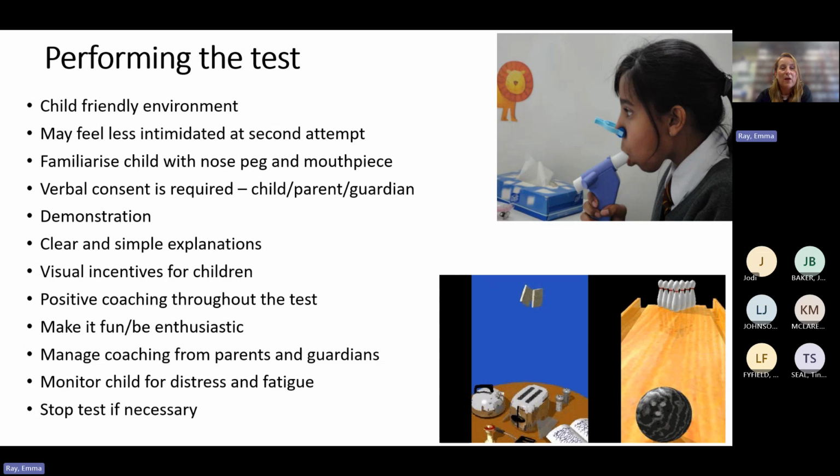But you just got to be polite and say, if the child can just follow what I'm saying, I'd be very, very grateful. Because you don't want the child getting upset if the parent is nagging them to keep going and things like that. But keeping an eye on the child to make sure they're not distressed or tired is really, really important. So they might need to do the test again. So we don't want to put them off at this early stage. So do stop the test if necessary. It's not about getting results at any cost.